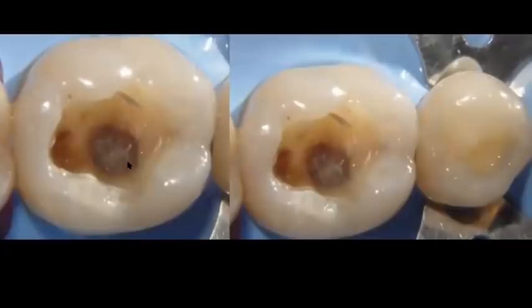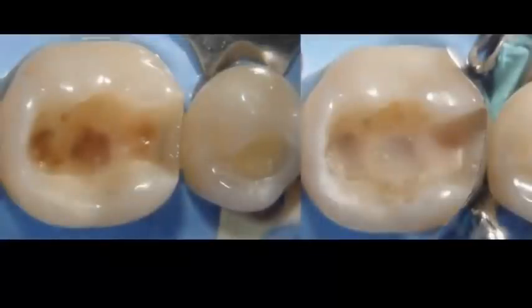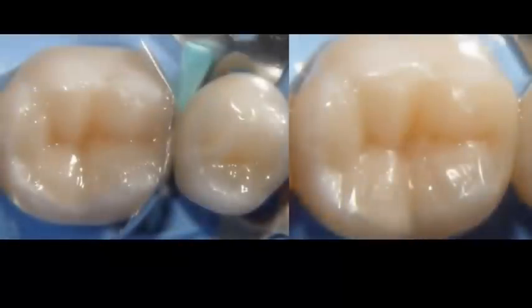There's some decay left behind, so we're going to go ahead and clean that area. Any deep areas that we find, we're going to go ahead and place our liner. In this particular case, we use Vitrebond from 3M. So we're applying our liner here. Now we're going to place our band. And again, we're going to start building the proximal wall. Then we're going to do our horizontal layer. And then we're going to start doing one cusp at a time. And here we go.